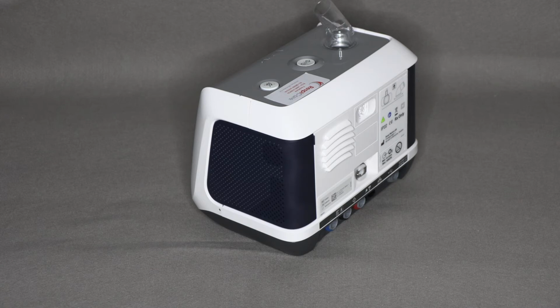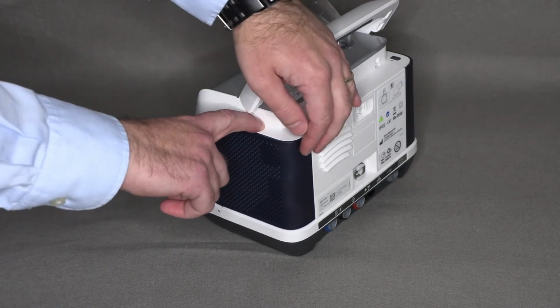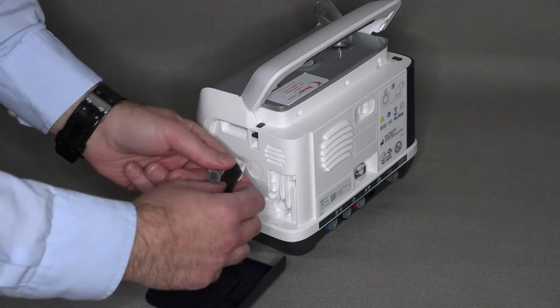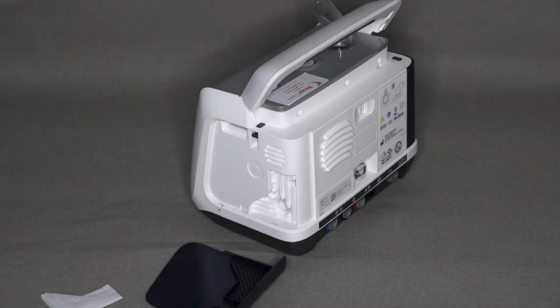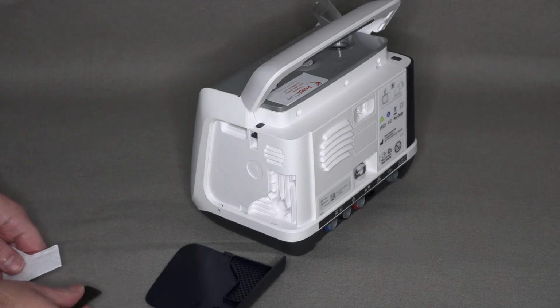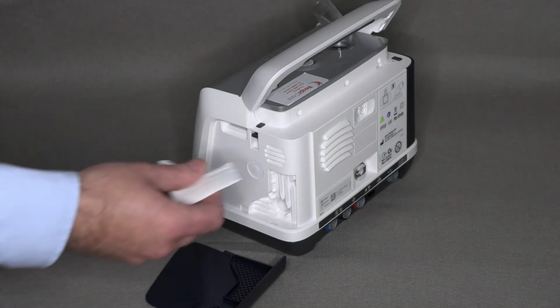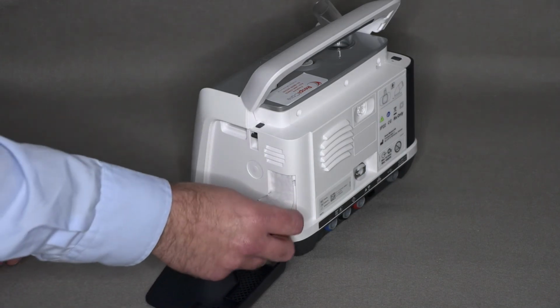Remove the side panel or door on the right hand side of the ventilator. To do this, lift the handle on the device and press the small button underneath. You can then remove the side panel and you'll find that there are already an air filter and a pollen filter inserted into the filter compartment at the air inlet. Each month, the dark dust filter should be cleaned and then reused when dry, and the white pollen filter should be replaced with a new one.